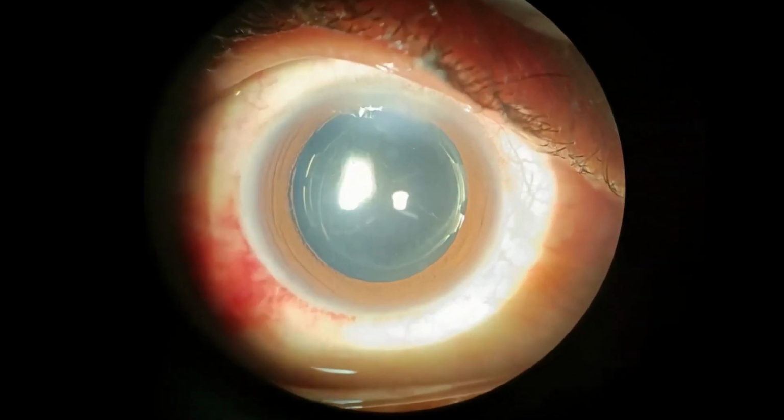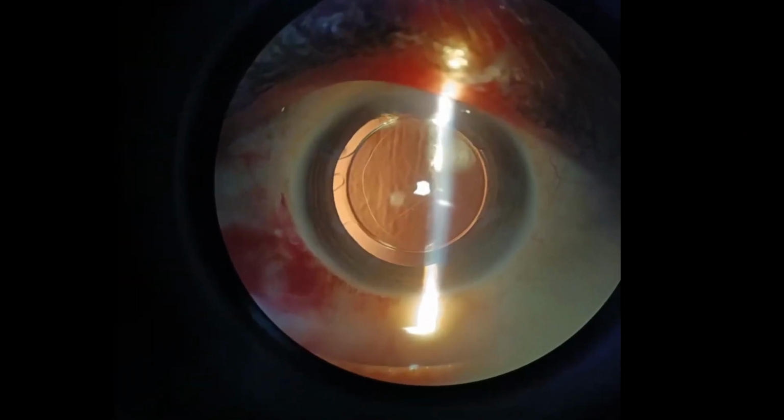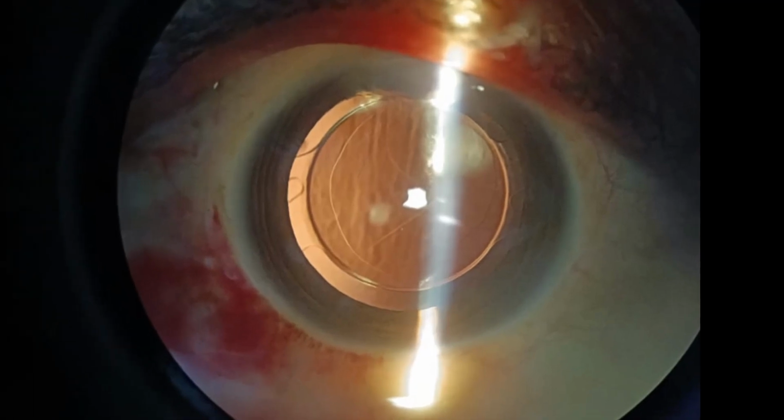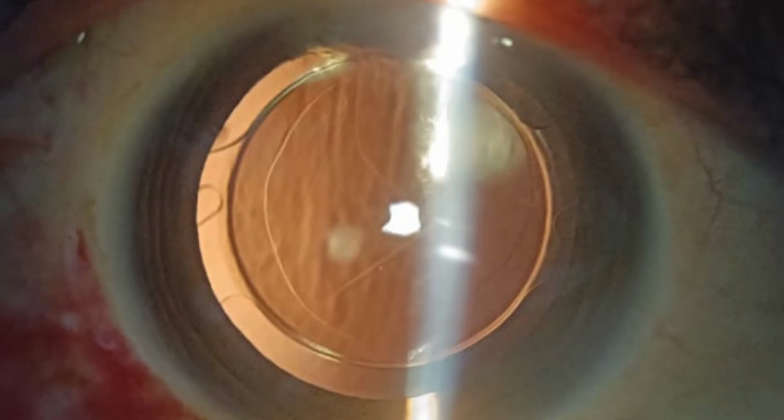This is the day 1 post-op picture, and we can appreciate in this second picture, which shows the glow and the IOL, which is well centered. There's some keratitis, but overall it was a good surgical outcome.